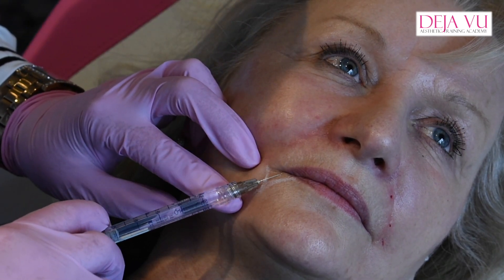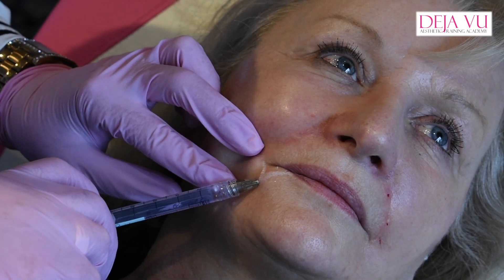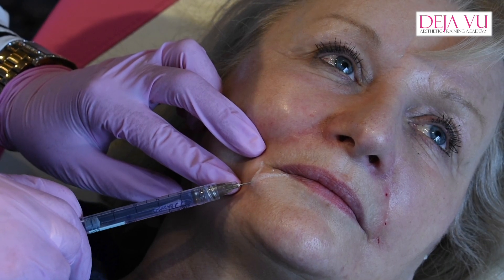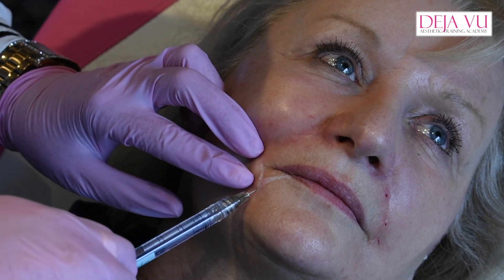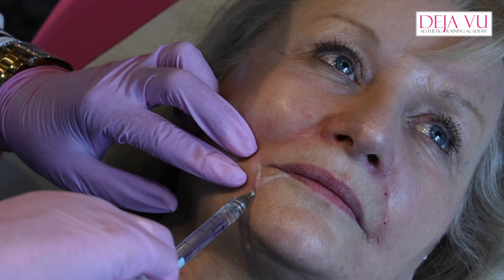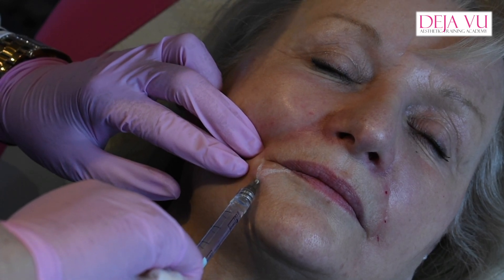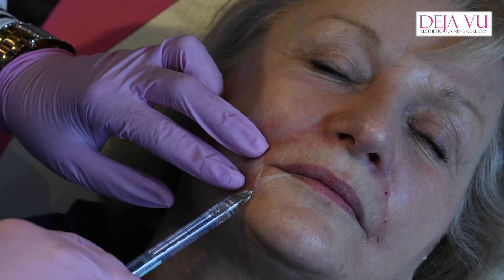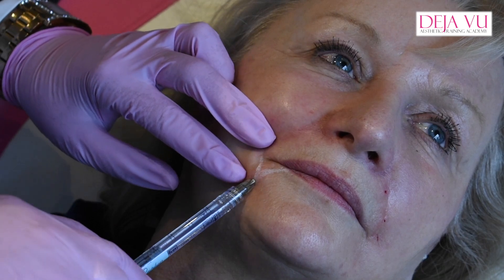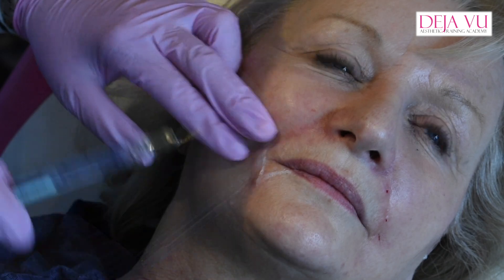So I'm measuring again, going in at 90 degrees. Going in at 90 degrees, push it up there. If you do a third of the needle, you're going to be at the right depth. And those of you that know me, I do my little lollipop just here, and that just helps to turn the corner of the mouth up.